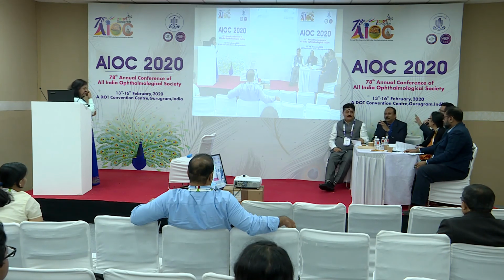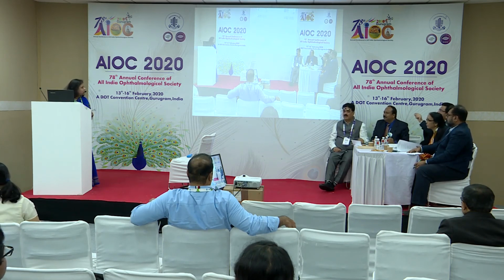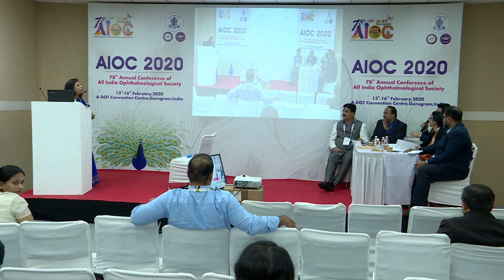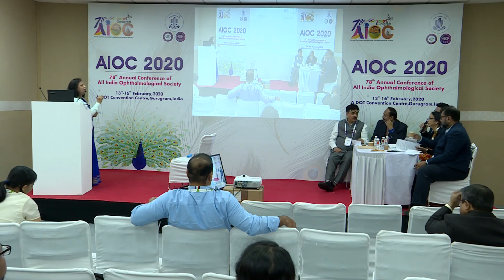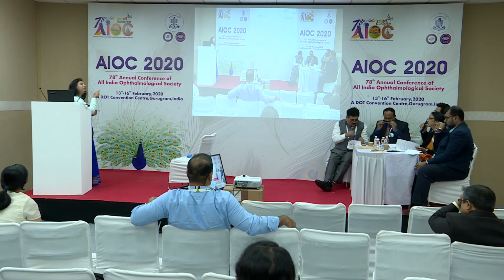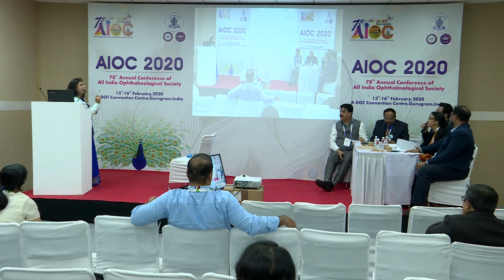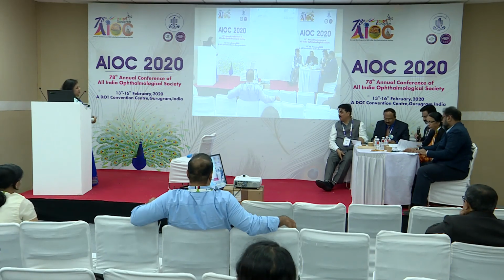Ma'am, just go back and check into your manual of the automated and just find out at what level it is measuring the keratometry. Sir, I have gone through this. It is said that the manual takes only the central part of the cornea and the automated takes 3.5 mm of the center of cornea. Correct. And orange colored dots are formed, and if they are defocused, the machine gives a beeping sound and you don't take the reading. Thank you, ma'am. Thank you, sir.